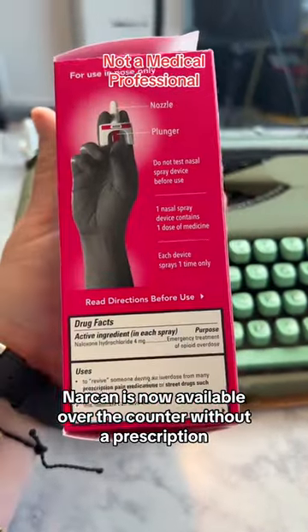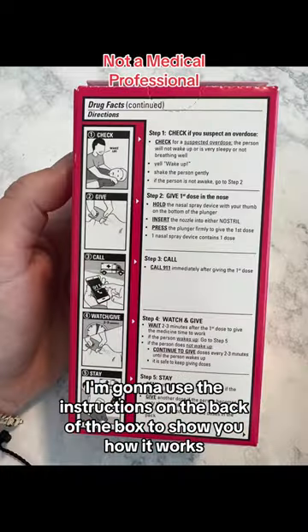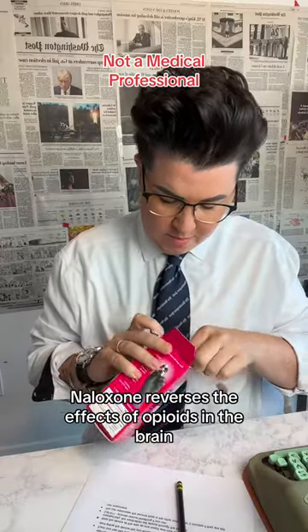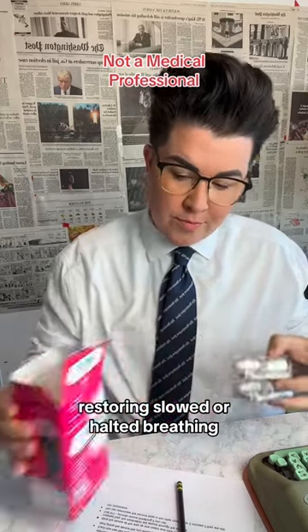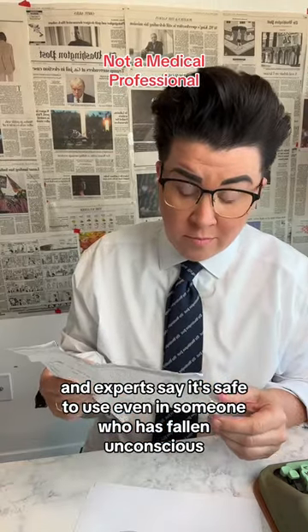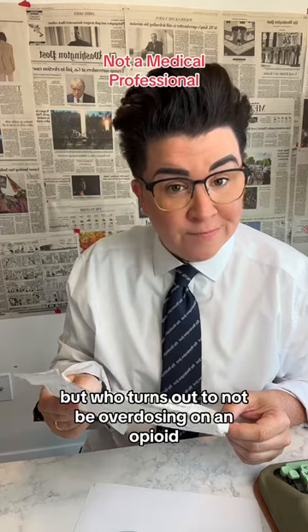Narcan is now available over-the-counter without a prescription. I'm going to use the instructions on the back of the box to show you how it works. Naloxone reverses the effects of opioids in the brain, restoring slowed or halted breathing. Experts say it's safe to use even in someone who has fallen unconscious but who turns out to not be overdosing on an opioid.